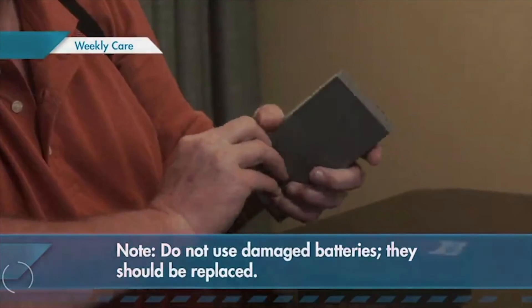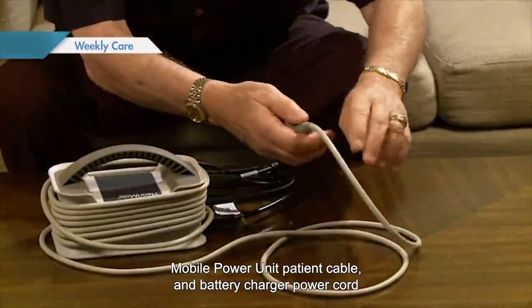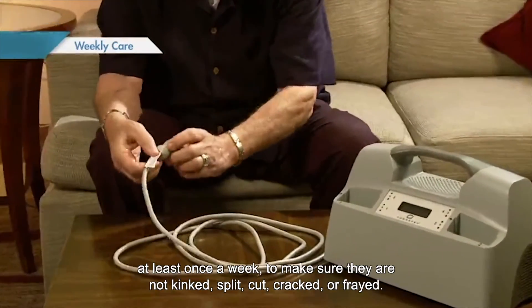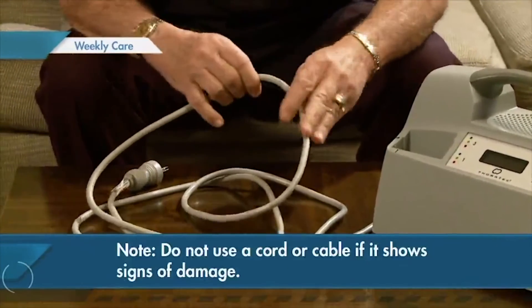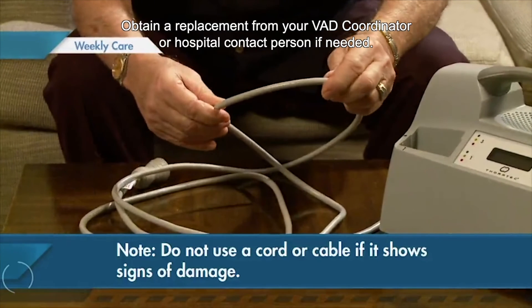Inspect the mobile power unit power cord, mobile power unit patient cable, and battery charger power cord at least once a week to make sure they are not kinked, split, cut, cracked, or frayed. Do not use a cord or cable if it shows signs of damage. Obtain a replacement from your VAD coordinator or hospital contact person if needed.